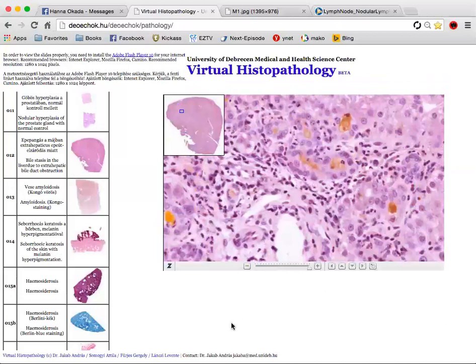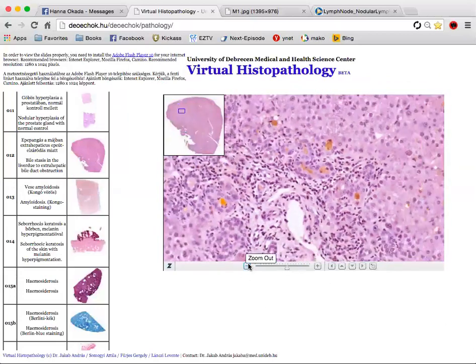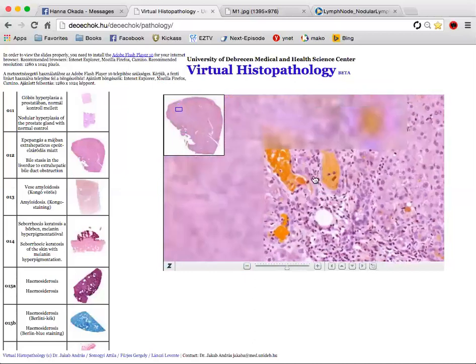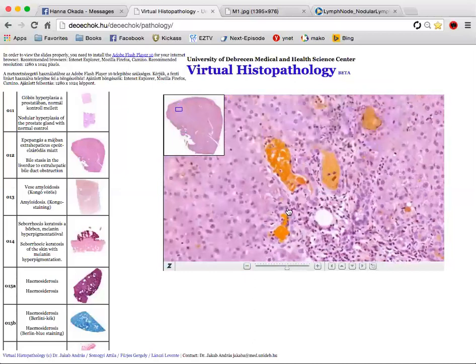The brown specimen which you have shown me before. Like the brown atrophy, you mean? No, that's not the same. This is bile stasis, which you showed like this. Yeah, that's all bile. So the pigment here is bile.